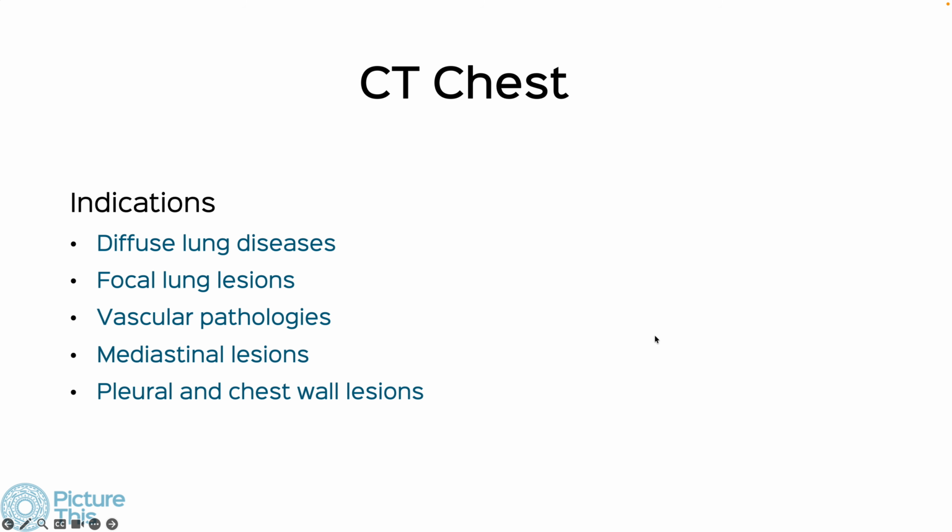So the aim today was to look at what CT chest can do, some that is standard, some new stuff, and ending with the fact that TB remains one of our major problems at all points in time.